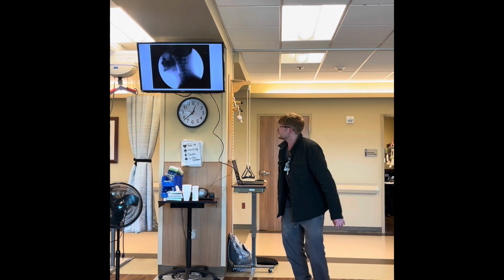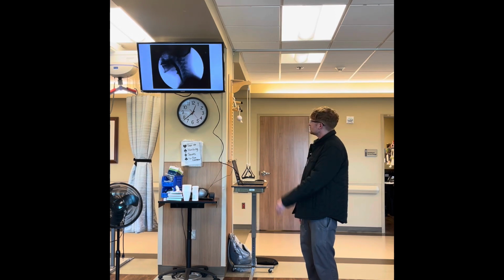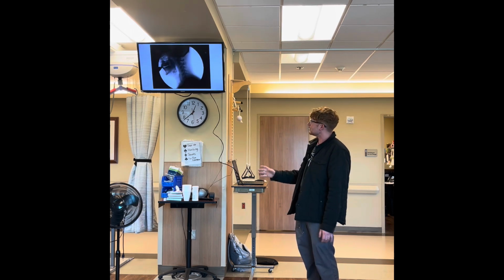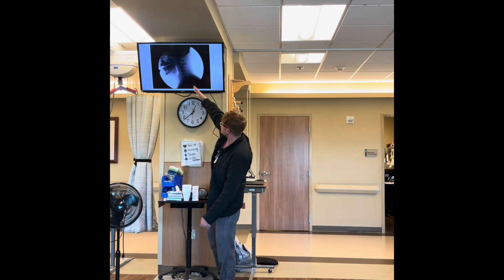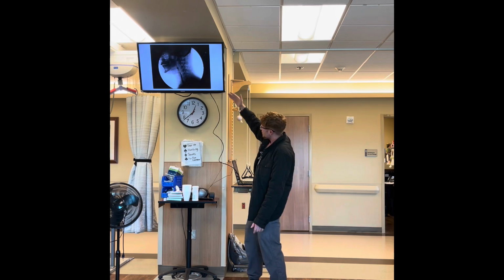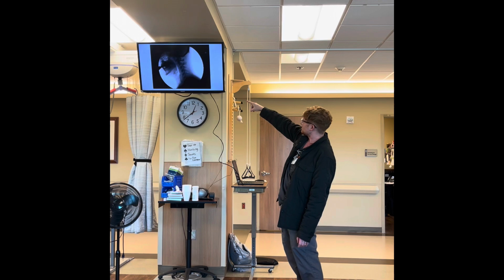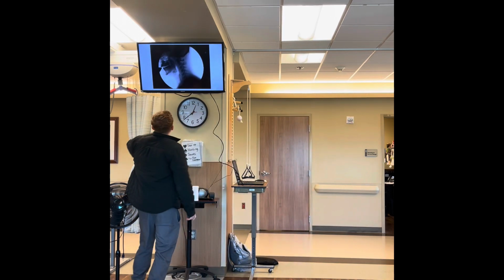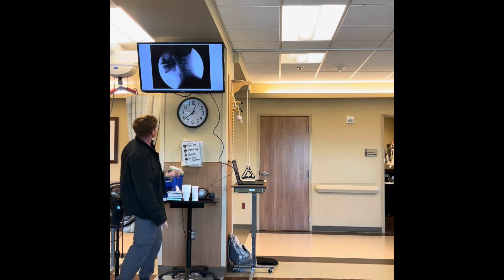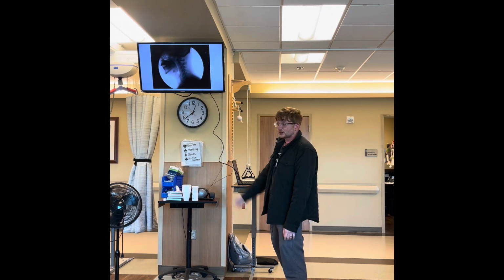Hopefully this is playing. Okay, I did find an image. This is an example of a normal one. This is kind of what we want to see. I can't really freeze frame it, but you can see, anatomy lesson, the side view. The white tube, that's the airway. And then the dark tube where the liquid is coming down, that is the food tube, the esophagus. You'll see a bone right there that comes up and the flap right there that comes down.